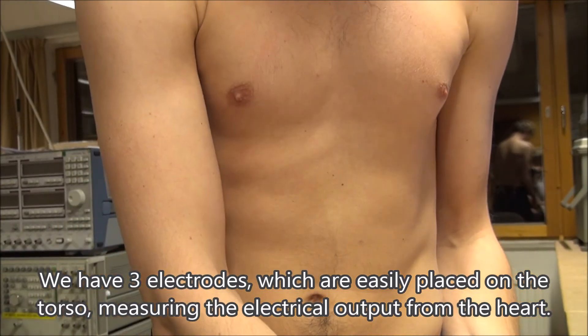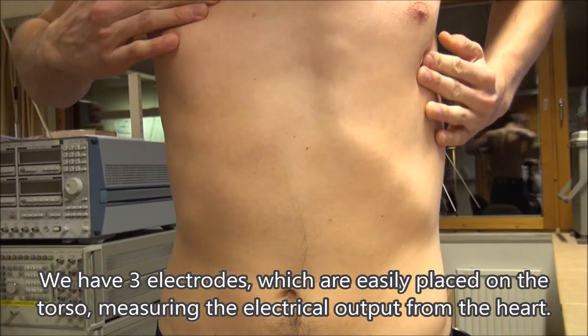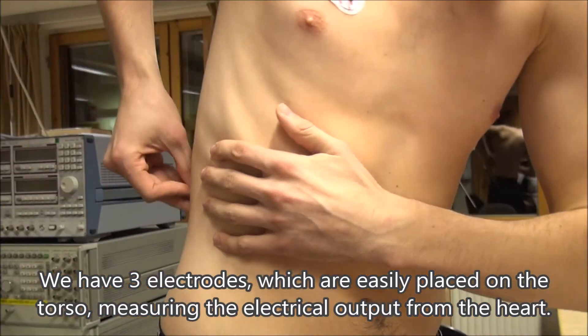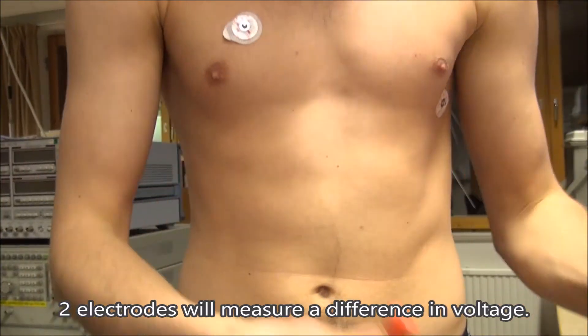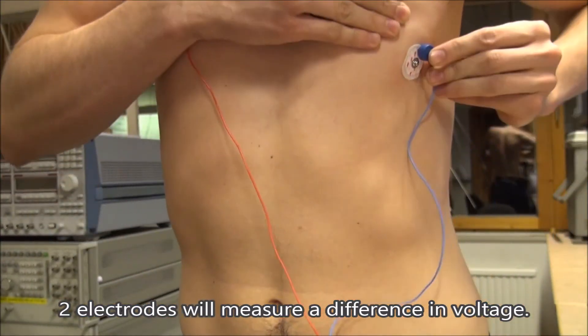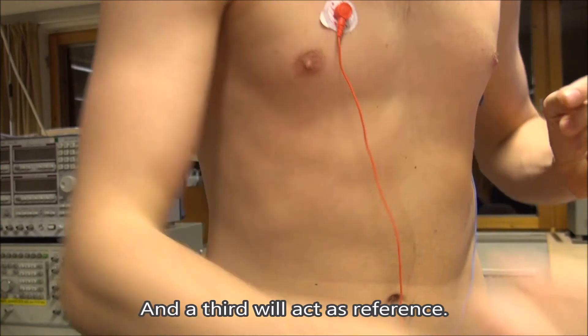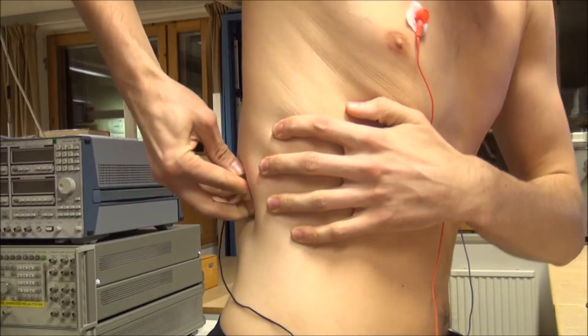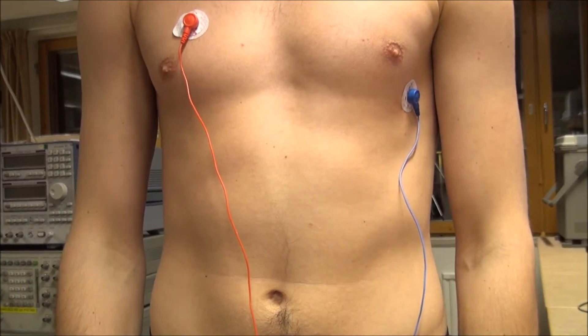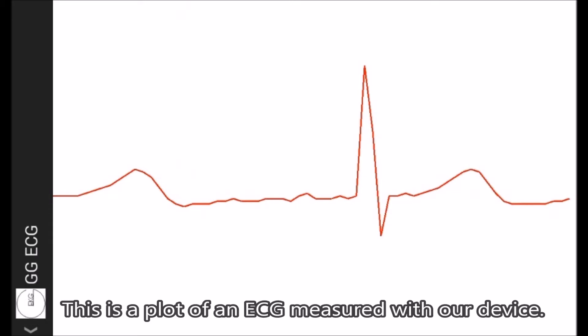We have three electrodes which are easily placed on the torso, measuring the electrical output from the heart. Two electrodes will measure a difference in voltage, and a third will act as reference. The sensors make an analog measurement and filter out the relevant frequencies. This is a plot of an ECG measured with our device.